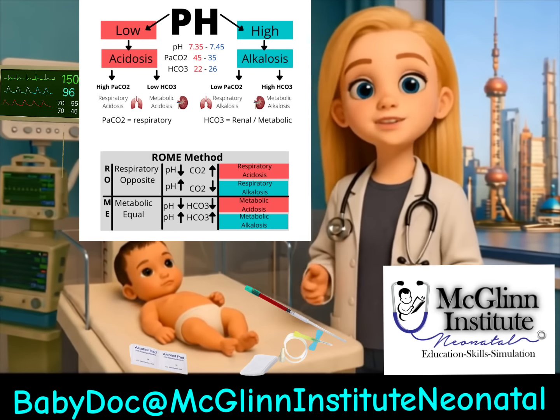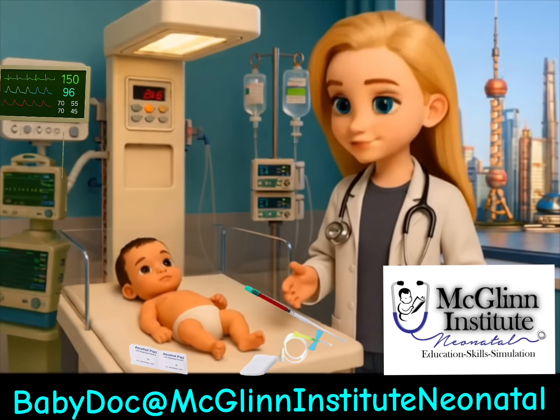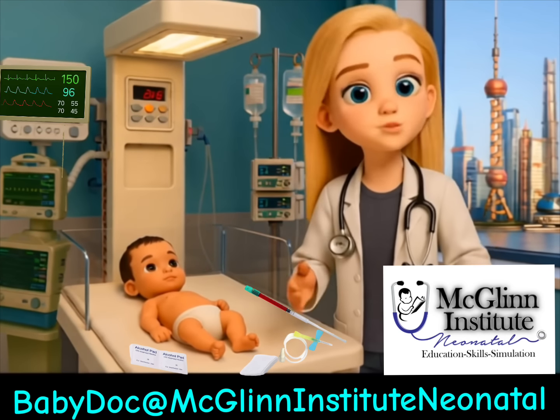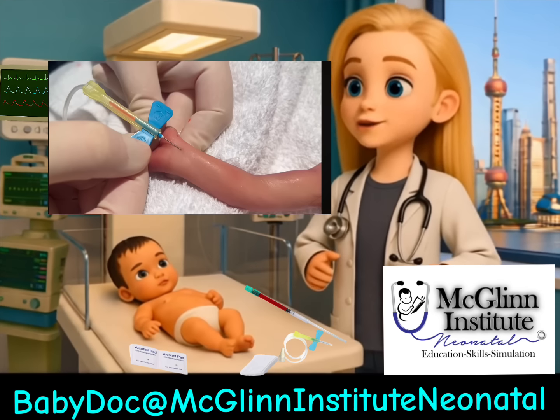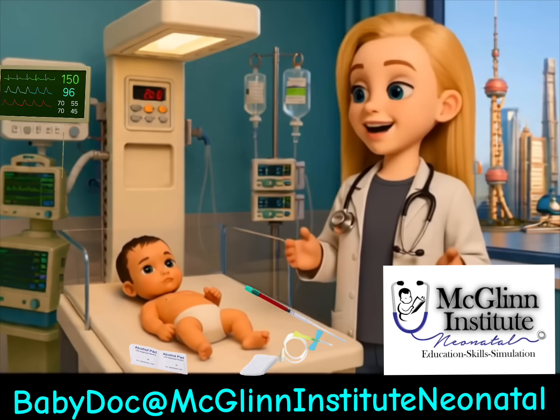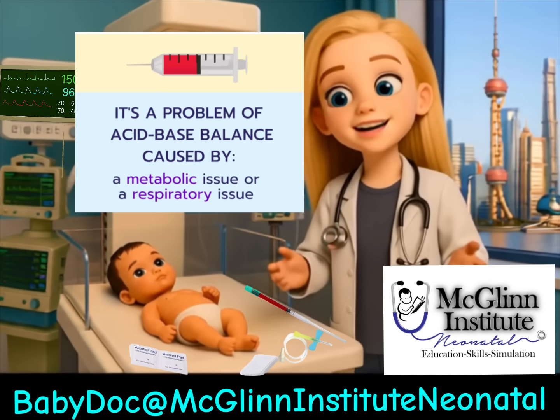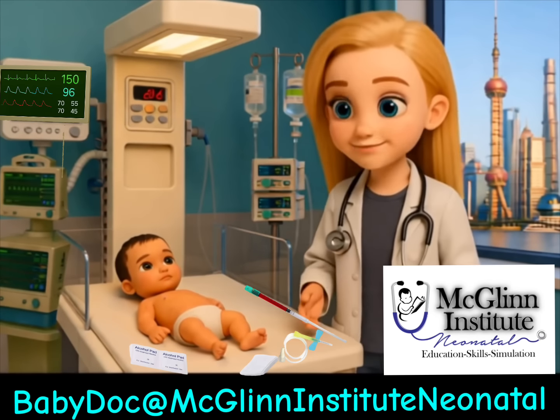A neonatal blood gas provides critical information about a newborn's acid-base status as well as respiratory and metabolic function. Normal values vary depending on the sample type, umbilical cord blood versus capillary or arterial blood samples, and the newborn's gestational age. Interpreting a neonatal blood gas involves a step-by-step process to determine if the origin of imbalance was respiratory, metabolic, or mixed.